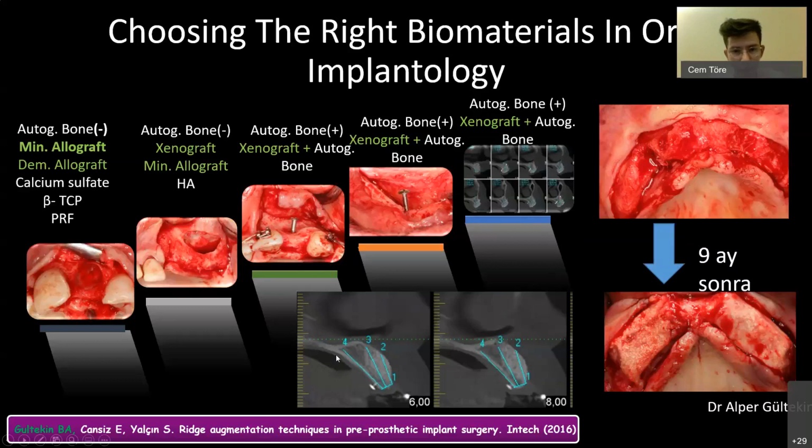Here, you can almost see the before and after in the same picture. This is the before, the part where the radio-opaque xenografts cannot be seen. And the full view is the after. And as we can see, there's a big difference. In one of them, you can't place an implant in good conscience. You will not have enough bone. You will probably have no bone on the buccal side. And then in the after, with the full bone we have here, it's very easy to place an implant comfortably.